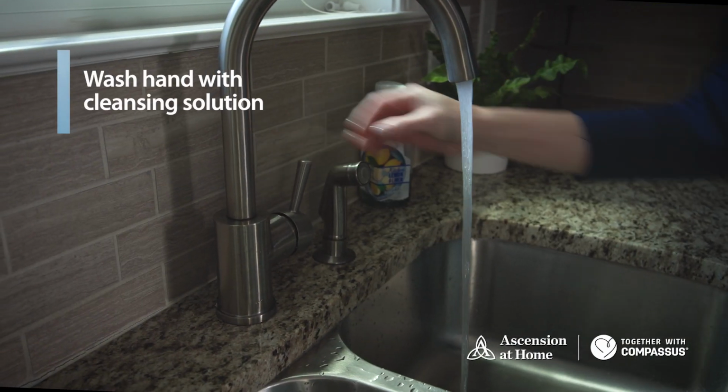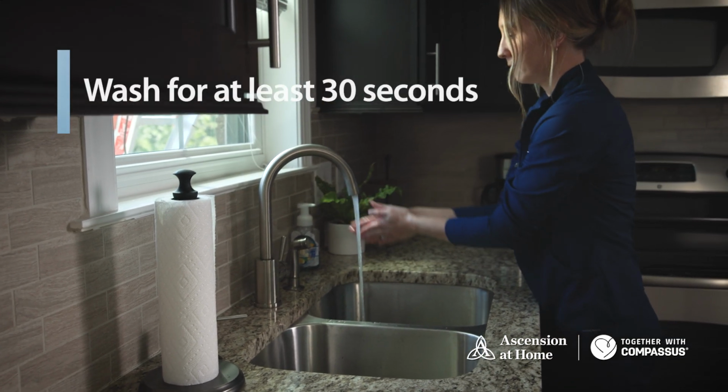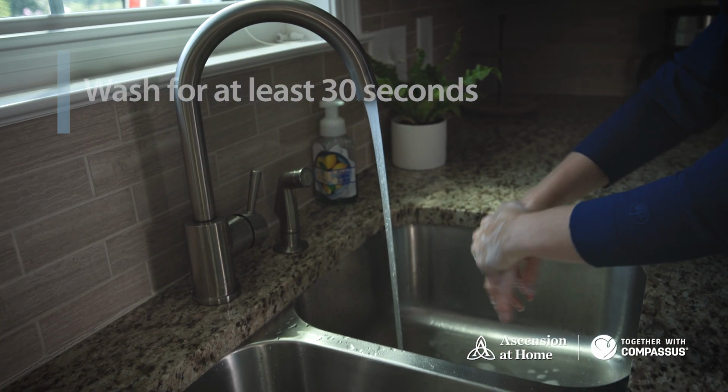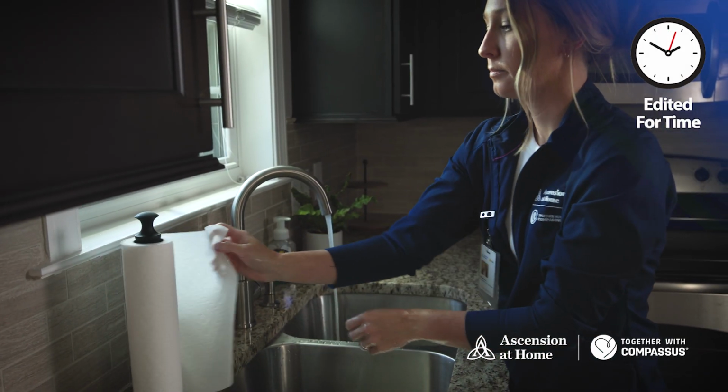Wash your hands with soap and warm water. Then dry them with a clean towel.